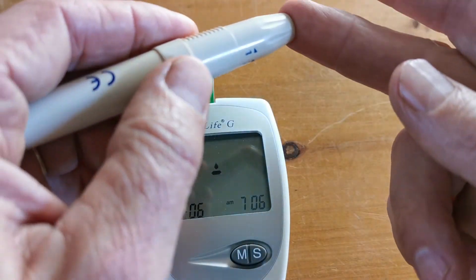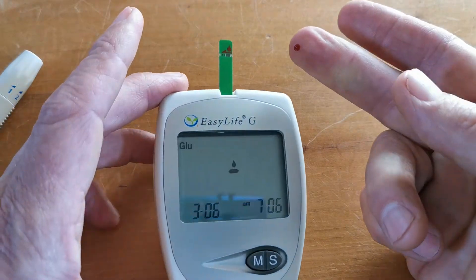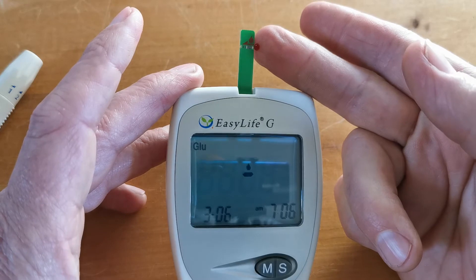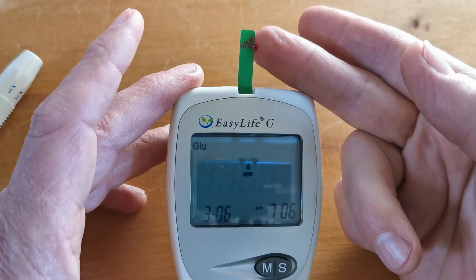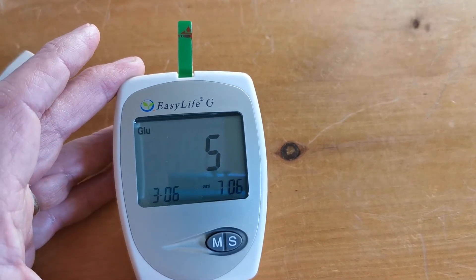Let me demonstrate that for you. I'm going to do a lance here. There's a nice sample being produced and it is applied to the side of the test strip. You'll see it going through — that has triggered now and you'll see the countdown starting.